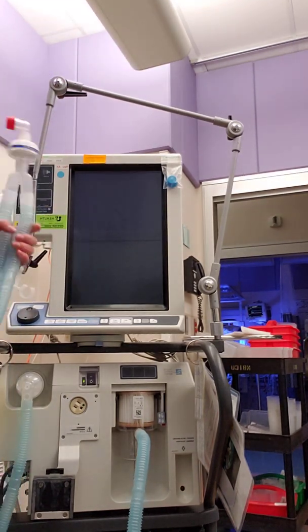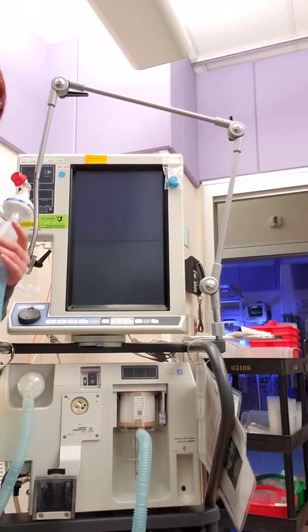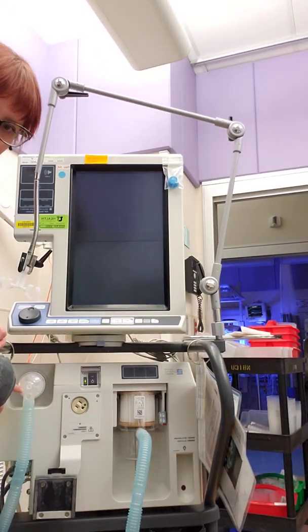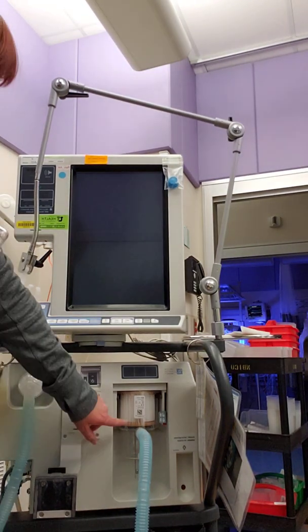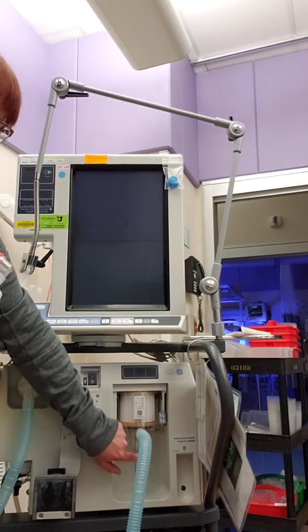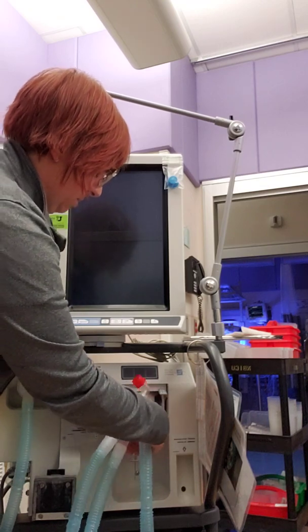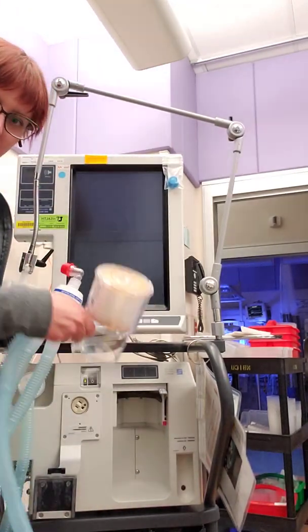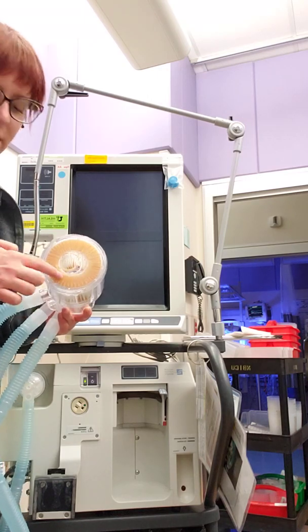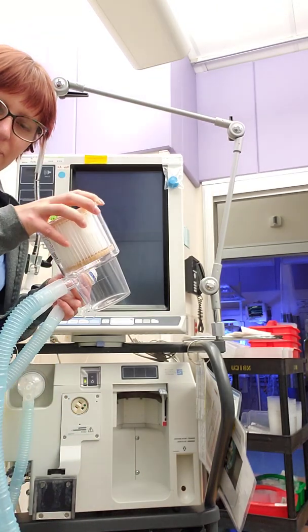And a few troubleshooting things. Check for leaks. Leaks are a really common complication that happens. So this port here is pretty common. This little spot where condensation comes out of is common. One that I've seen quite a bit is people will try to really shove this expiratory filter on and the top will crack, or there will be a crack somewhere in this expiratory filter and that will cause a leak.